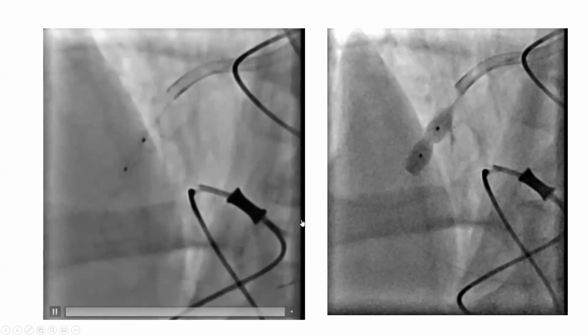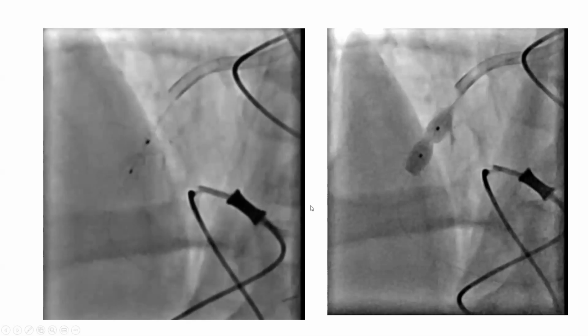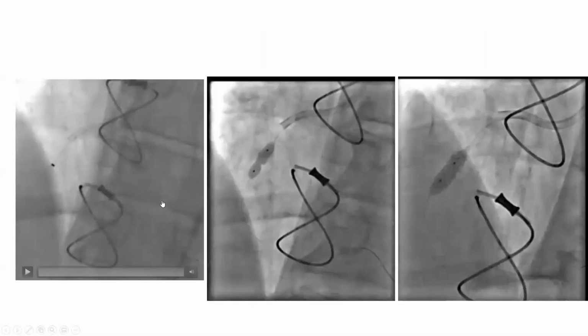They tried to balloon with high pressure, 25 atmospheres, non-compliant balloon, to no avail. So eventually laser atherectomy was done. Even laser could not allow stent expansion initially. So we had to use a 1.7 millimeter laser catheter, because this is a big vessel. We start with 0.9, then we upsize to 1.7 millimeter laser, and then we used it with contrast. Afterward, we used a cutting balloon, and we were able to make that lesion fully yield.